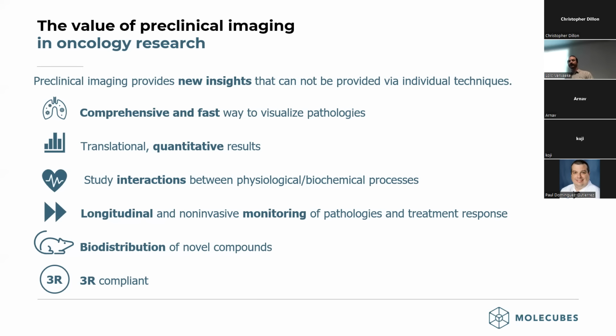And then lastly, which is becoming more and more important in this world as well, is the 3R compliance. So it's a reduction in your use of animals, if you can have a single animal with multiple image time points instead of having to terminate your animal every study.